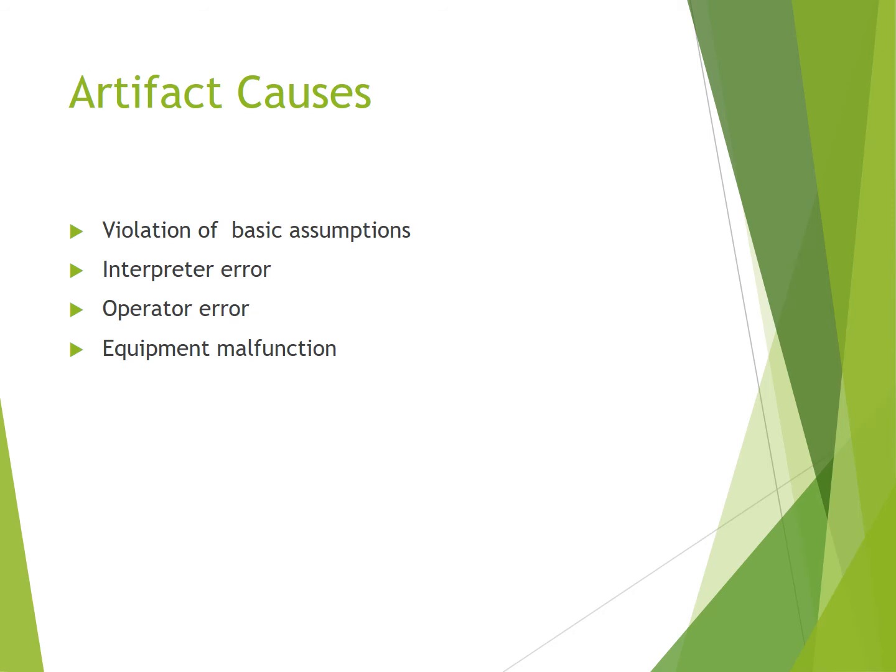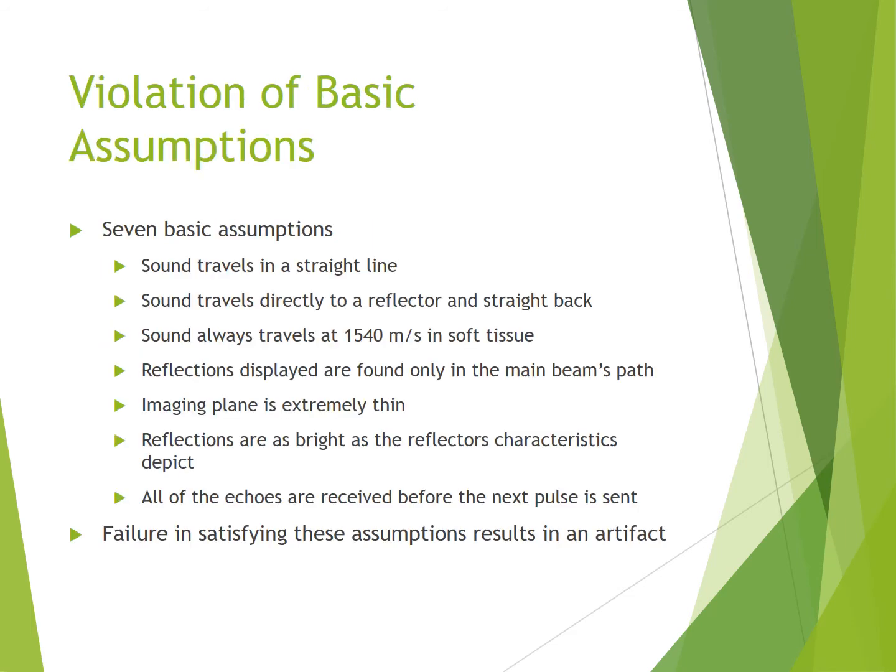True artifacts arise from a violation of basic assumptions that the ultrasound is making in regards to how sound works within the body. There are also artifacts caused by interpreter error, operator error, and then we can also get some artifact caused by equipment malfunction. So most of our artifacts are going to come up because there is a violation of basic assumptions. You're going to want to know these 7 basic assumptions. Make sure that you understand what they are and how they affect artifacts on our machine.